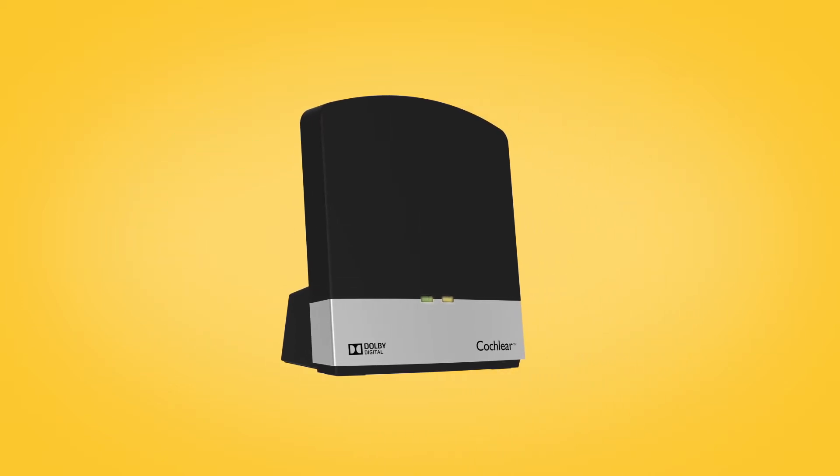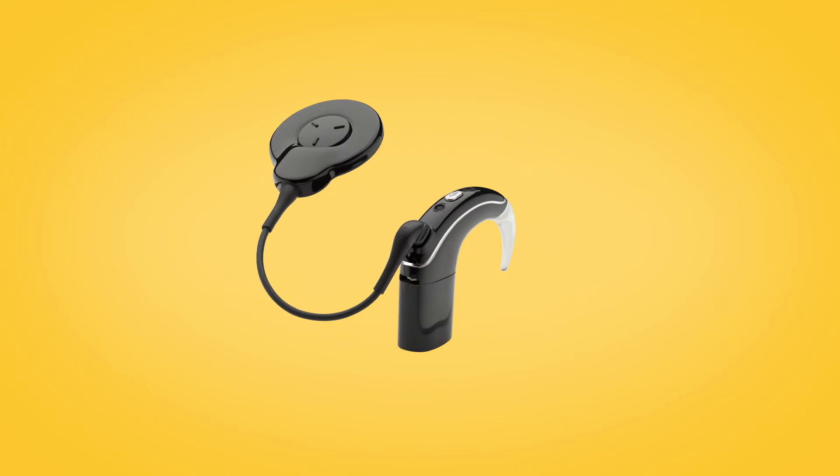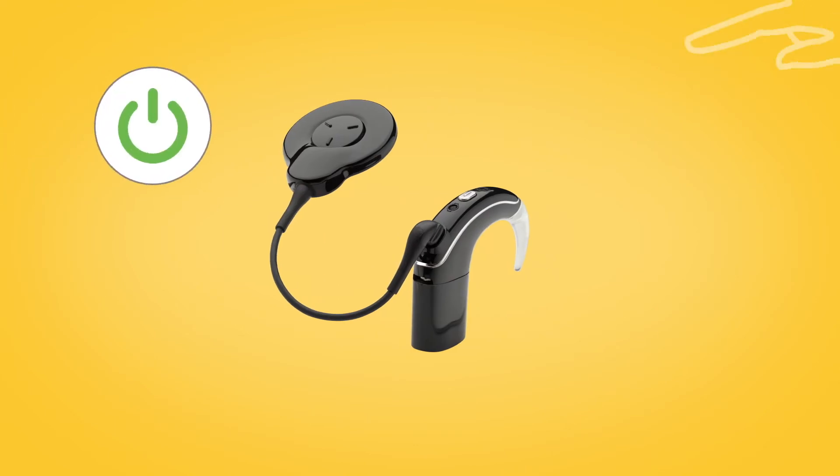The TV streamer's activity indicator will flash orange to indicate it is in pairing mode. Pairing mode lasts for 20 seconds during which you should switch on your sound processor.